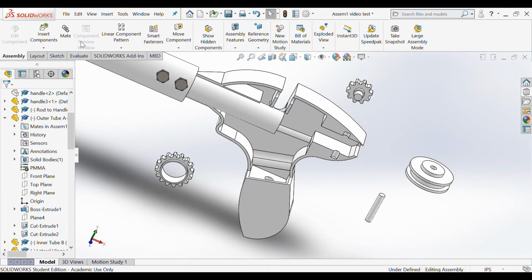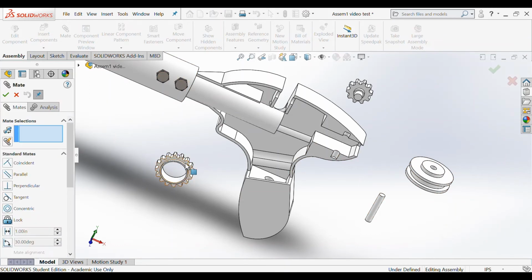So first things first, I'm going to mate this inner gear to this inner rod attachment piece. And then this gear right here is going to go on the top, and that's going to help with the 360 rotation. This gear will rotate this gear. And then this side dial will rest on this axle, which will be placed right here. So I'm going to show you how to do that.